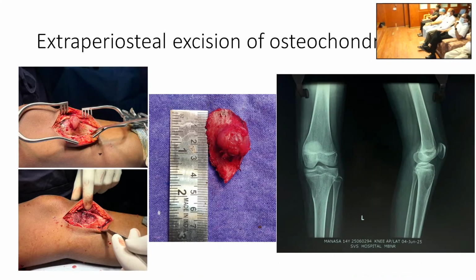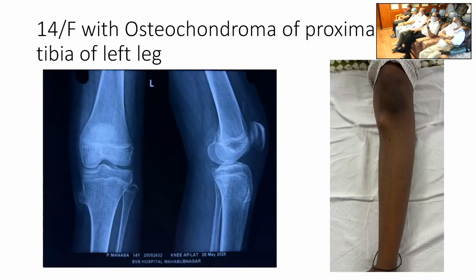So 14, go back. Growth plate is not closed. Yes, sir. Female, okay, very unlikely. She may not be 14. Generally at 14, what do you think? 14, 16, maybe. Growth plate is a bit more open than usual for a 14-year-old girl.